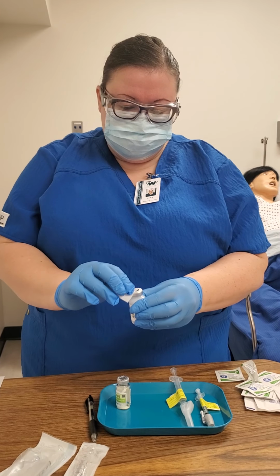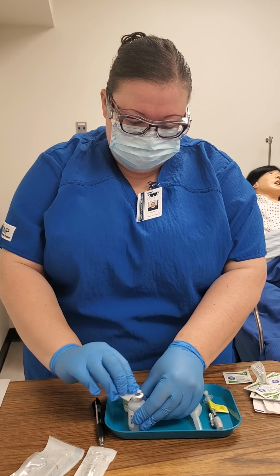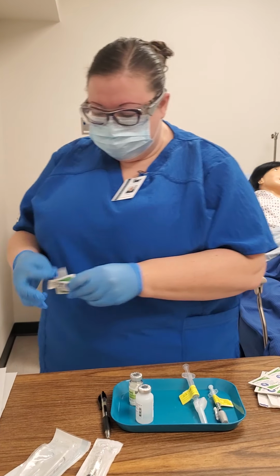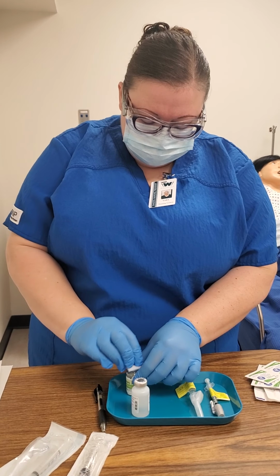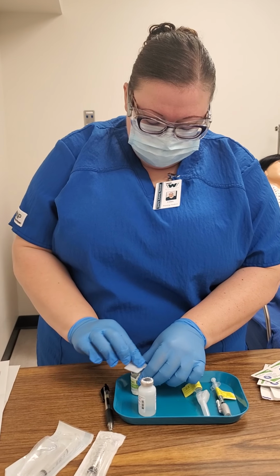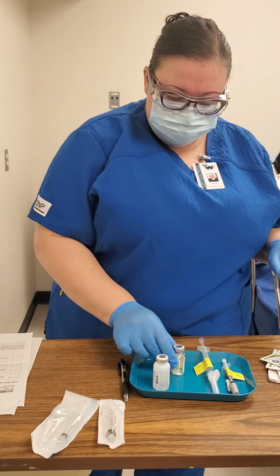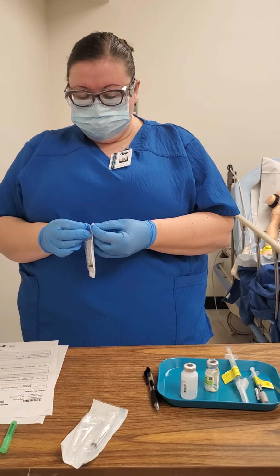And an outward motion, 15 to 20 seconds here for this one. Okay. And then another 15 to 20 seconds on this one. That outward motion. Okay. So first I'm going to withdraw my saline solution.